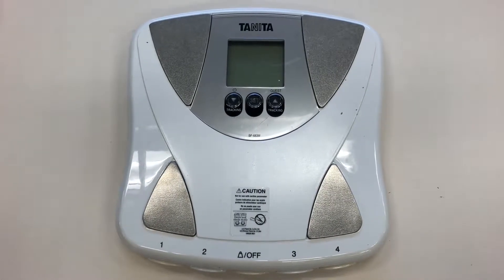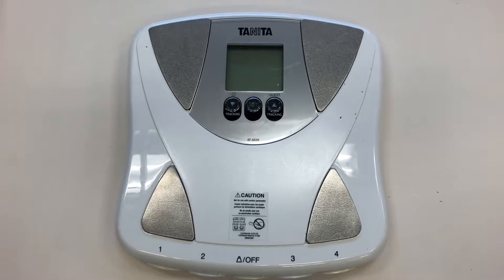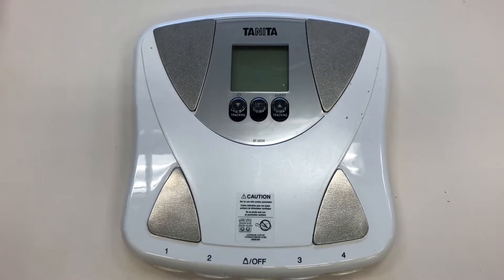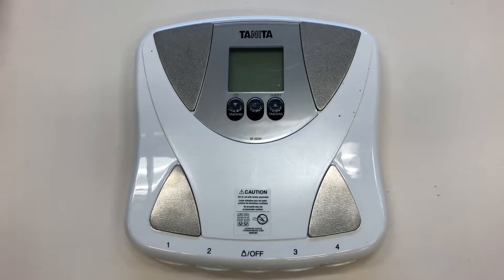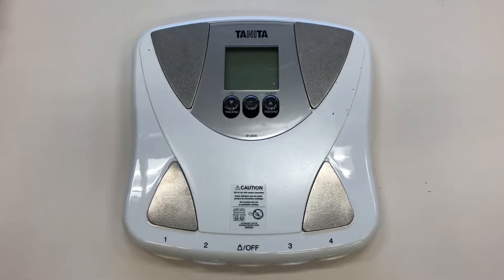This is the BF683 Bioelectric Impedance Analyzer, one of the ones that we're going to be using in the lab today. In the past, students have stated that some sort of video of the equipment would maybe be helpful, so this is our first foray into that, and we're going to show you how to use the BIA scales.